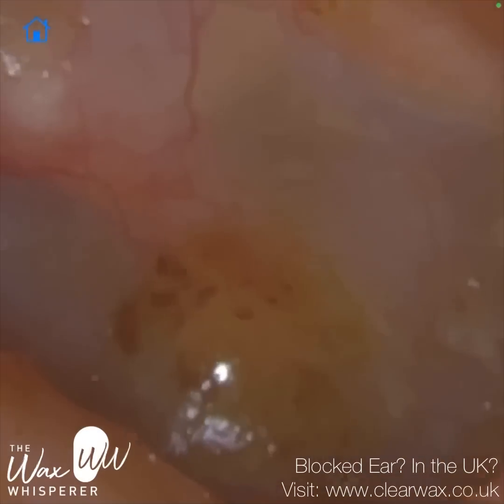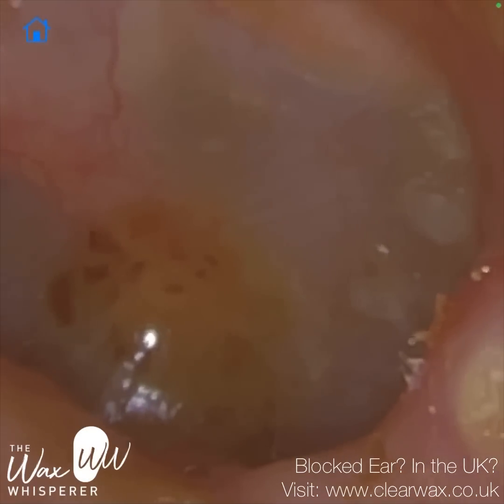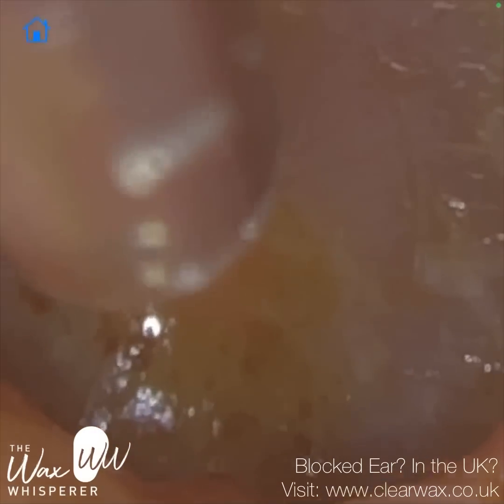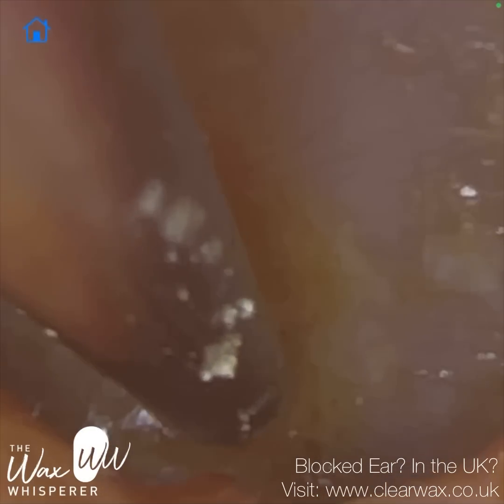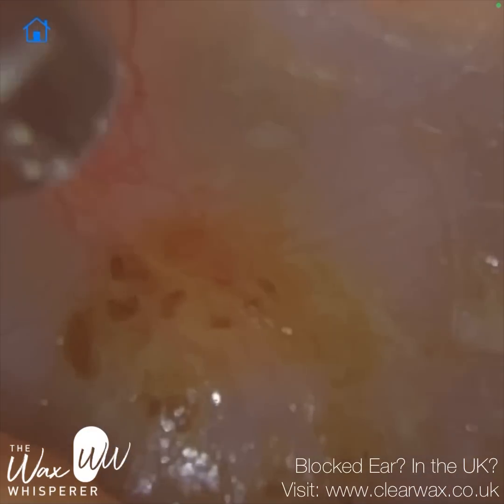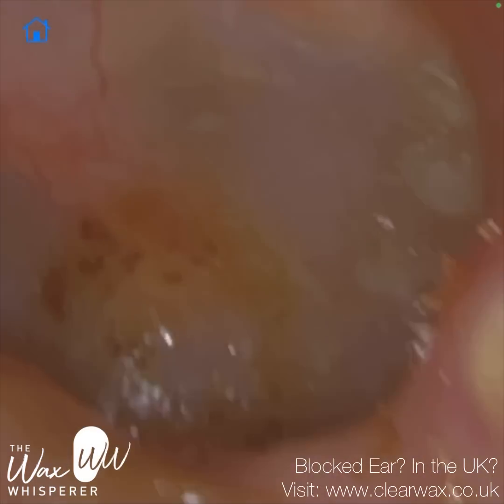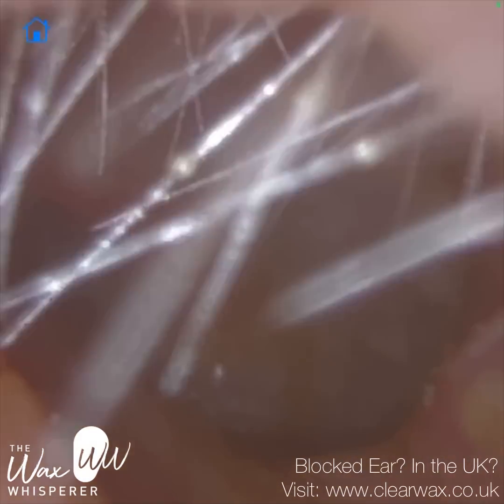The zoom function would be quite useful here. We're really zoomed in — it just looks as though I've got the endoscope deeper in the ear, but I haven't. The endoscope is still near the entrance of the ear. The zoom function can be beneficial in that way: if some specialists are cautious about inserting the endoscope too deep, with the zoom function you don't have to. The endoscope is literally near the entrance, and you can view deeper into the ear without further inserting it. That's another useful benefit.